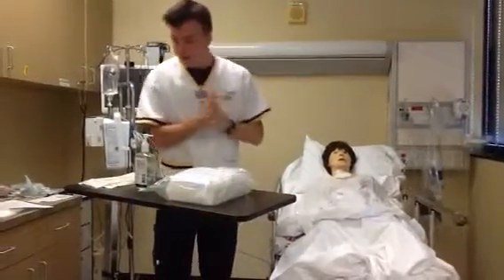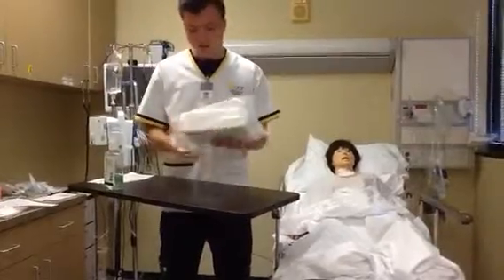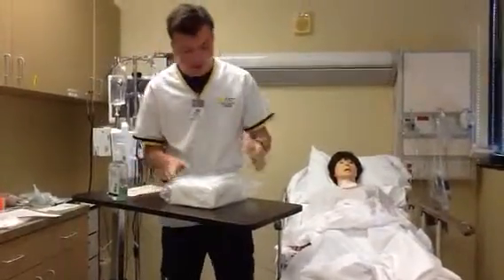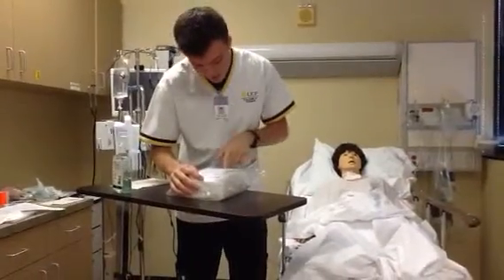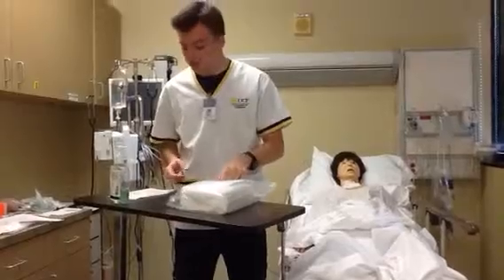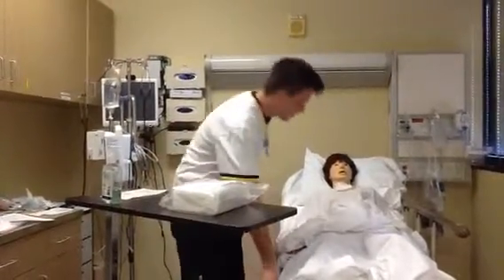Alright, and I am back. I have my catheter kit. I have a pair of sterile gloves, an extra pair of sterile gloves, and I noticed that this catheter is 14 French, which I can confirm with the provider's orders. And we are ready to insert the catheter.